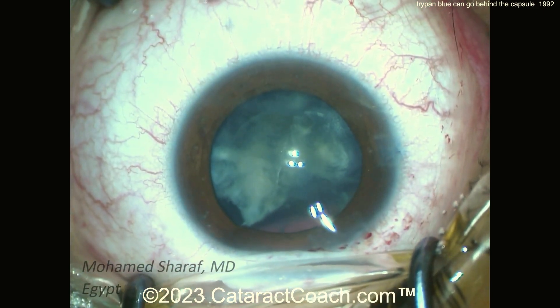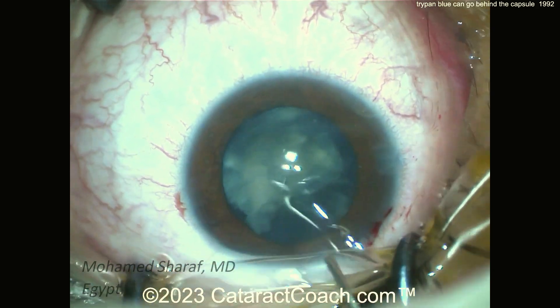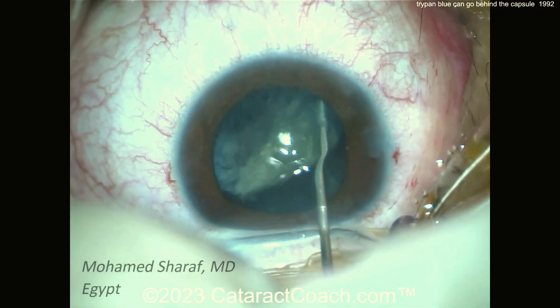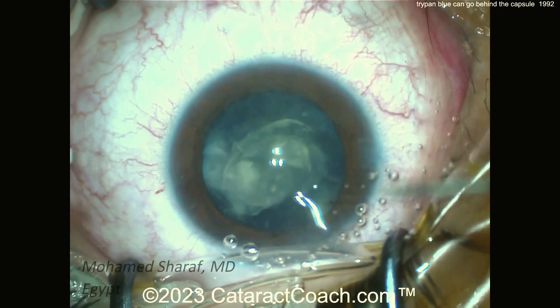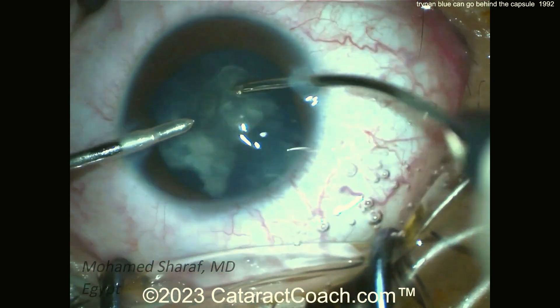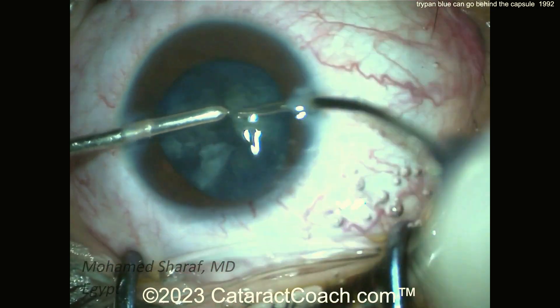The surgeon made the main incision and is now using regular forceps to complete the capsulorhexis. Another pair of instruments is probably for bimanual IA later. A little hydrodissection — you can even visco-dissect here if you want an extra barrier, using a dispersive agent. No phaco probe needed; it's a soft lens, just bimanual IA removing all the lens material.